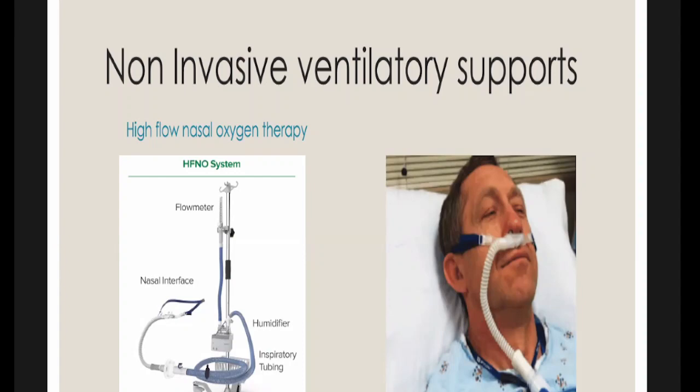Because of the high flow rates, it is very handy especially in weaning patients, or when we are stepping up our respiratory support. It is a good adjunct from non-invasive to invasive ventilation. You can see the inspiratory tubings, and this is the humidifier. And this is the stand where it is fixed.